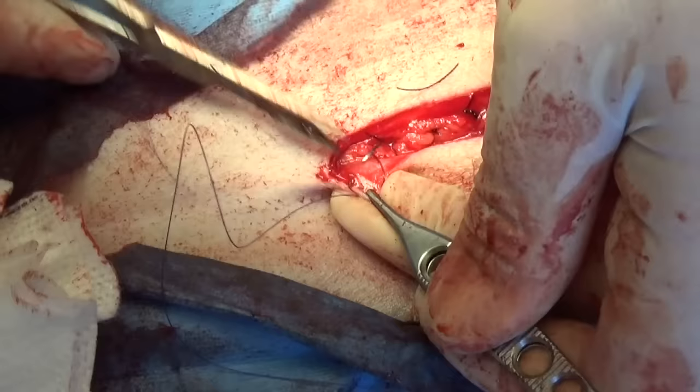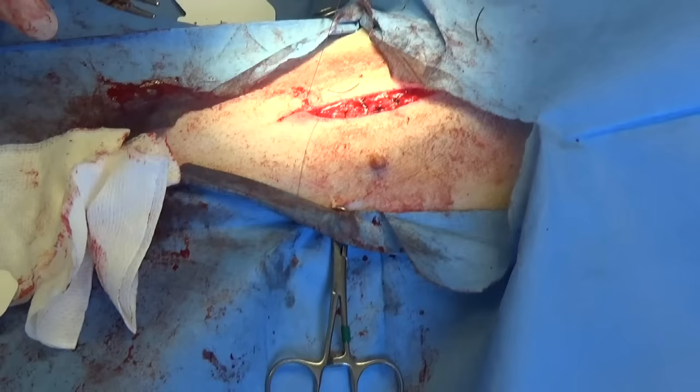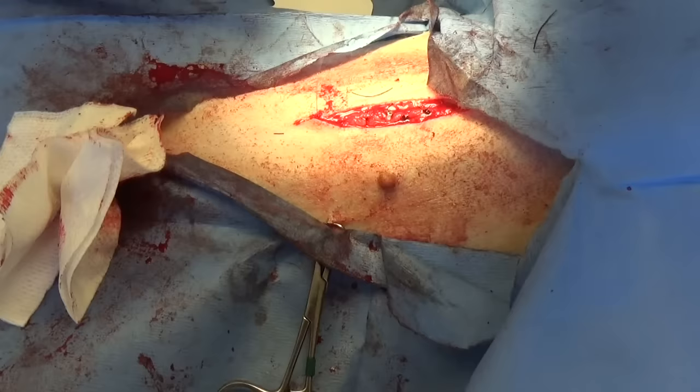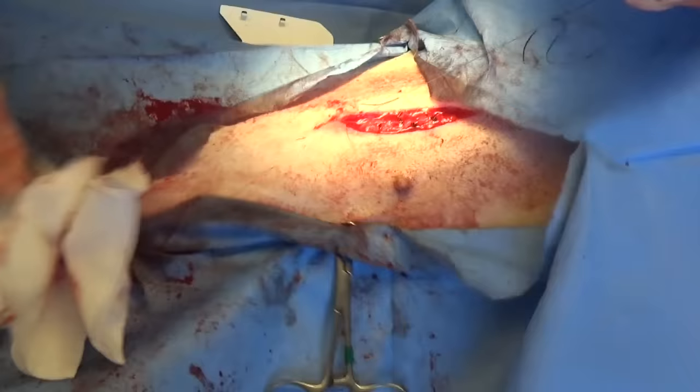Oh, look at that suture trying to stick out. This is the better holding stitch than outside sutures. You see, in outside sutures when you have surgery, this stitch is better at holding all the tissues together. Because you saw me hold the very bottom and then the sides, and it brings everything together and eliminates the space we've caused.